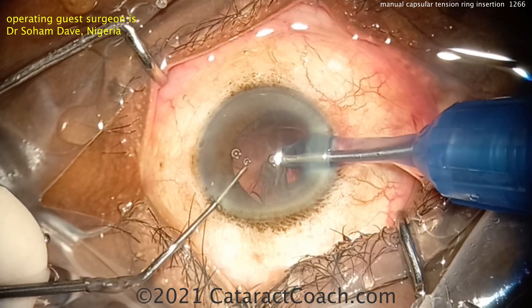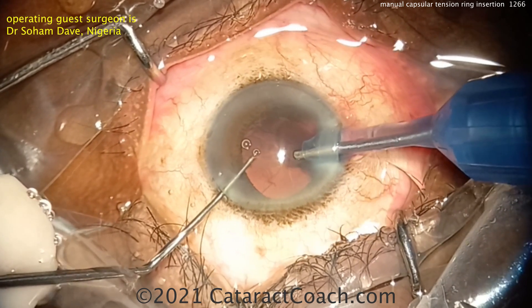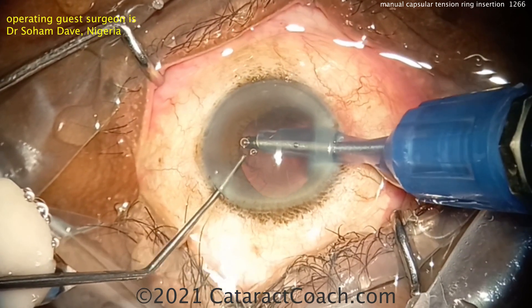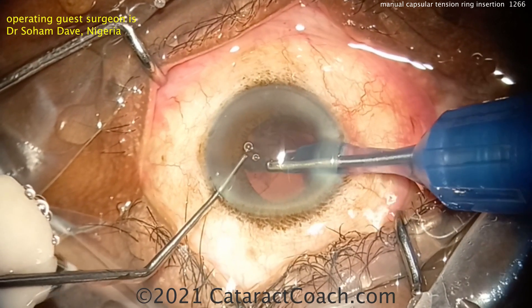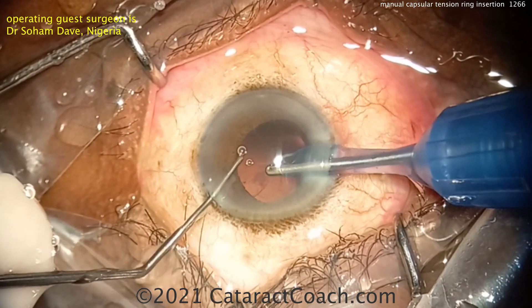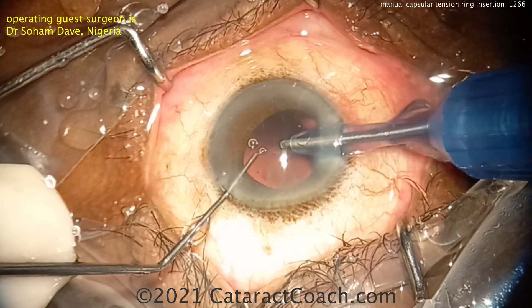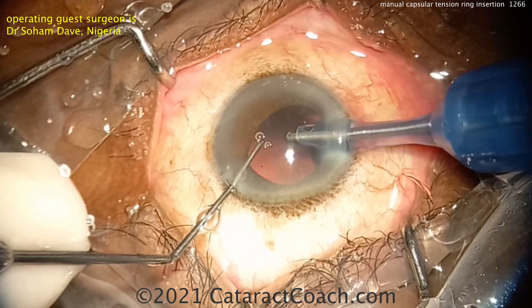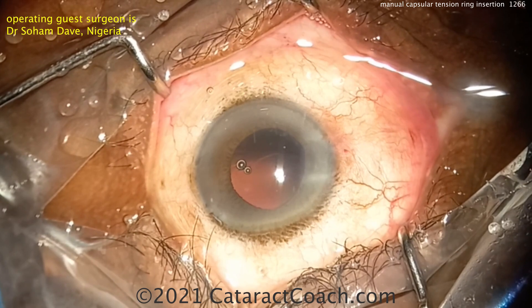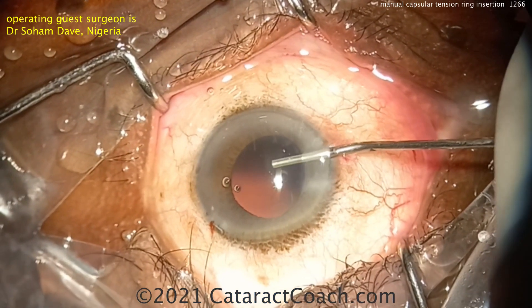Look to make sure the capsule is not going to move. When you do this, look at your rhexis edge — if the rhexis edge moves, that's probably not a good thing. The cortex is coming out nice and easy, slowly and gently. Take your time. It's just cortex, but there's suspected weakness of the capsular bag and zonular supports, so very carefully — most of the cortex has been removed.